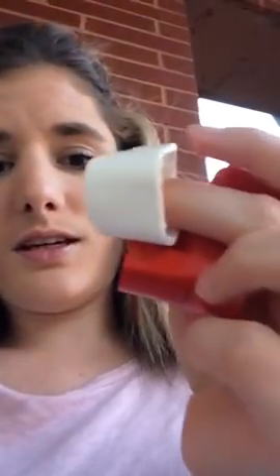So I have a ProAir inhaler for occasional asthma, and I'm going to show real quick how to use this for the 64-year-old patient. Okay, so we went through the steps. Make sure you shake it. I just removed the cap right here, and I'm going to take a fast, deep breath, and then I'm going to inhale the medication and hold my breath for 5 to 10 seconds so it can go fully in. And then I clean it after, and that's everything.